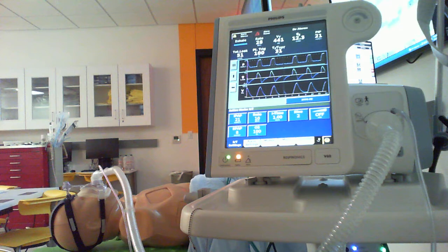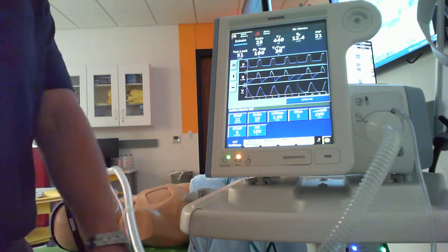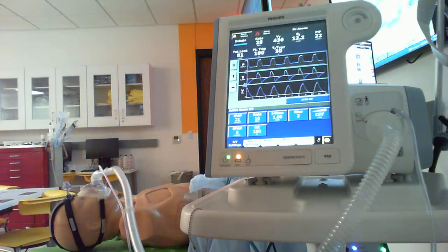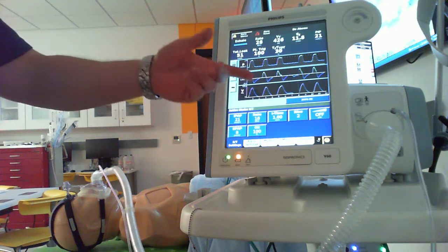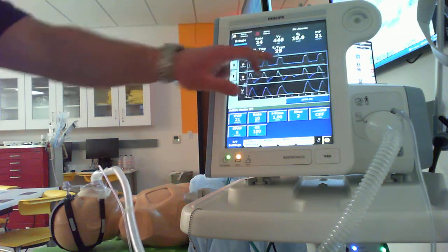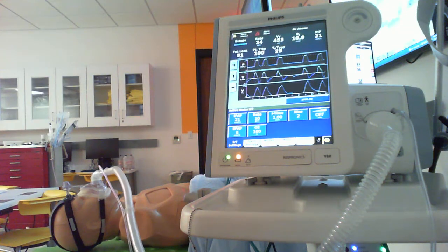We'd like to see mental status improve. We'd like to see respiratory rate improve, vitals improve, all these different things. And once again, we'd like to be able to get down to about 60% FiO2 and still reach our oxygenation goal. As we learn more about graphics, we could use RISE to further adjust, but looking at how pressure is building in the circuit up here, everything looks good. I keep monitoring this guy. We talked about how to give a neb if we needed to. All right, he's okay right now, so we continue to monitor and hope for the best.